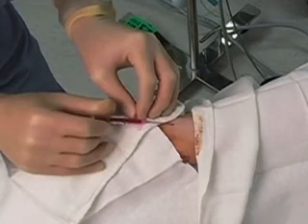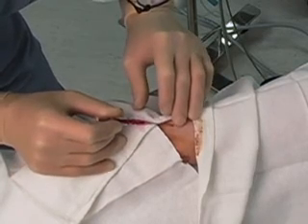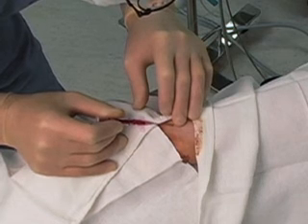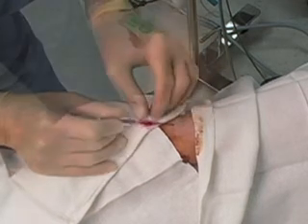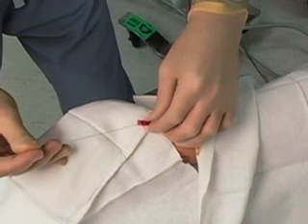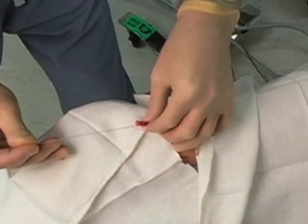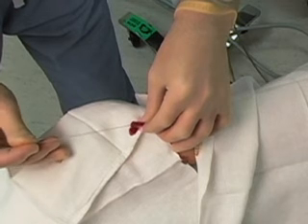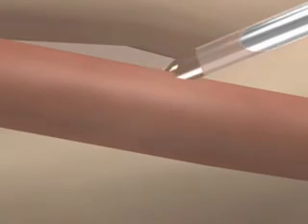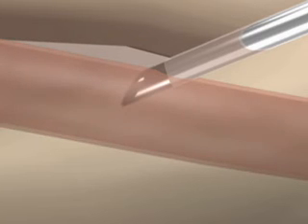There are some common problems that can occur during arterial line placement. If in the over-the-needle technique no blood return is obtained after the initial flash, the catheter can be advanced through the vessel and the over-the-wire technique can be employed. Occasionally free flow of blood is observed but the catheter will not pass easily. In the animation you can see how the tip of the needle might be within the vessel while the catheter remains outside.